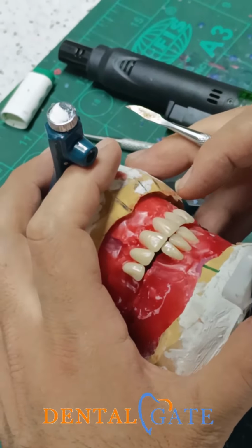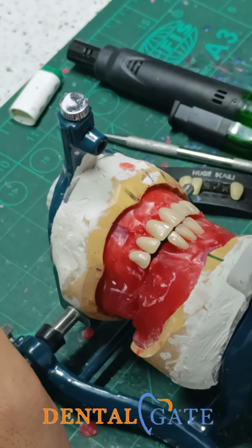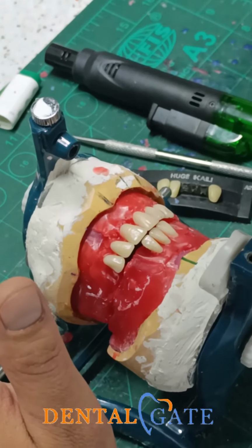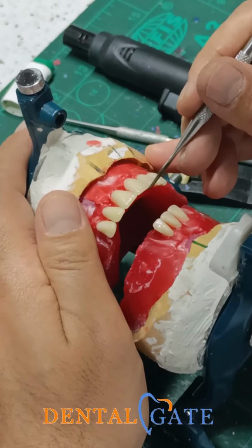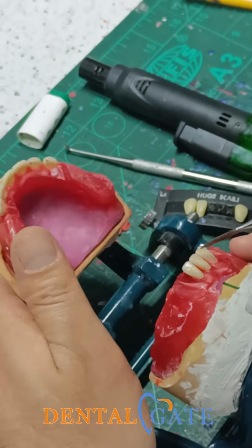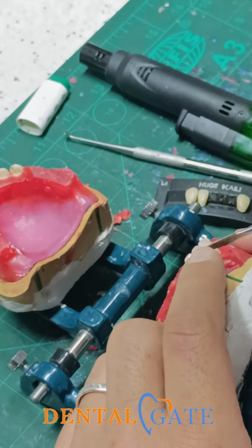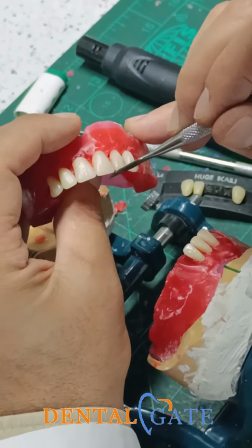Regarding the bite, if you want to make it with the bite, we don't make it exceed the bite. Why? We need to make it within the central incisor, because we had a shortage and need to compensate this shortage. Sometimes you can make the lateral incisor higher than the central. Why do I need to make that? To compensate this 1 millimeter space of the lateral, okay?